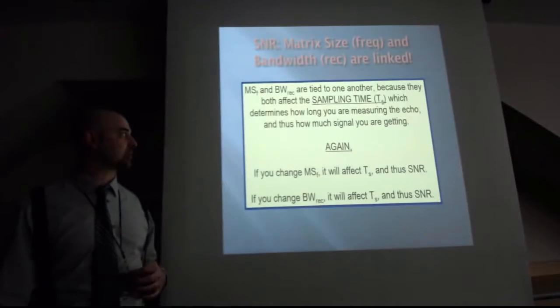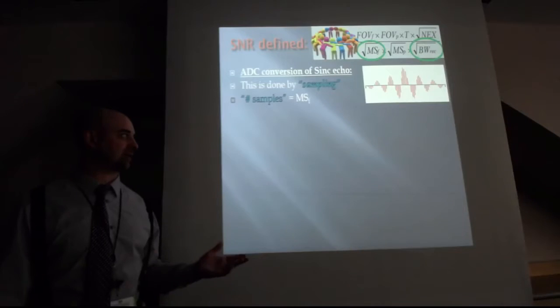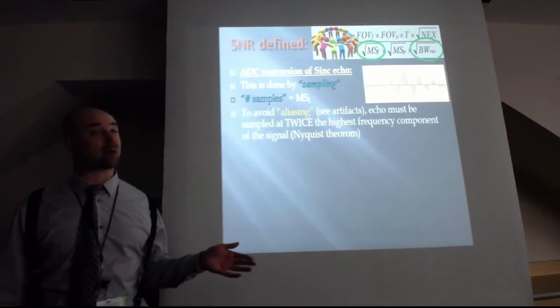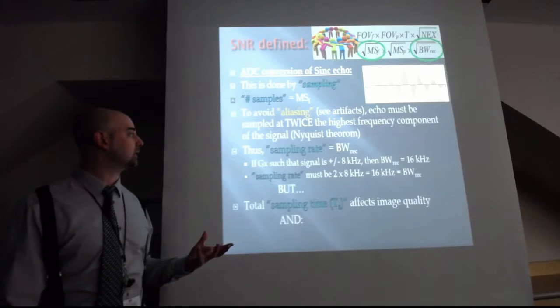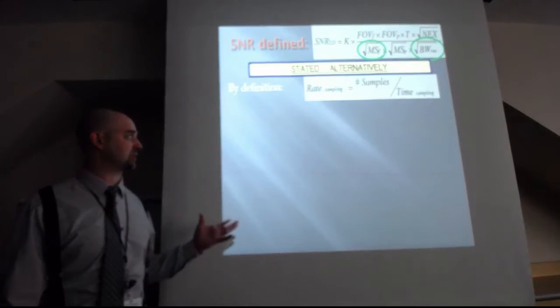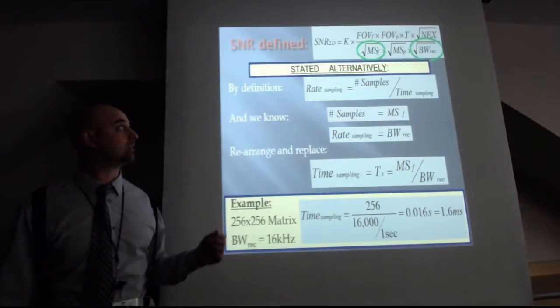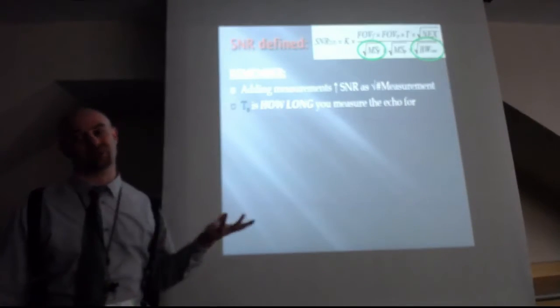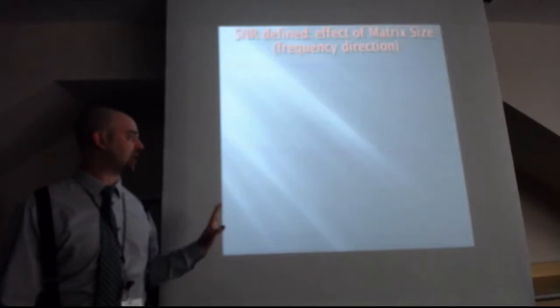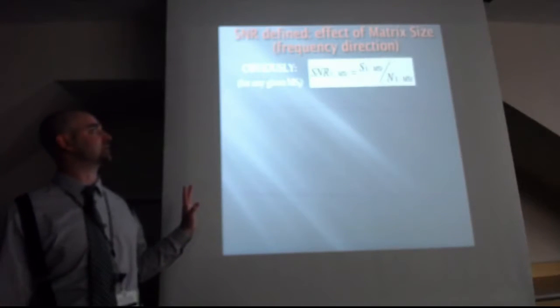So a little bit of a review, and then I go into how it actually relates back to sampling time, which is something that people don't usually consider in the textbooks. And as a result of sampling time, the MSF actually does increase the amount of time you spend listening to an echo, which would partially undo it. But I'm not going to go through that because it'll just confuse you.